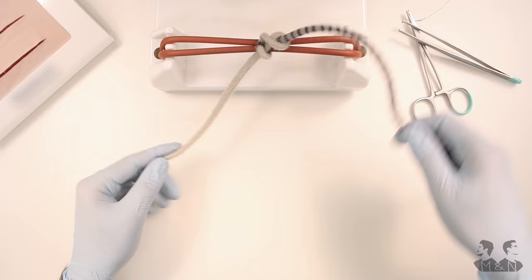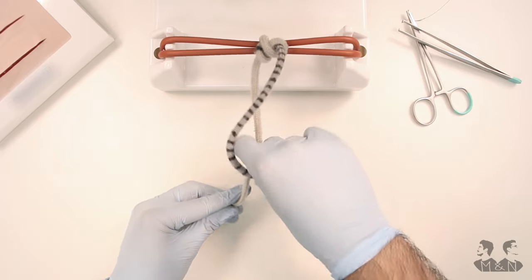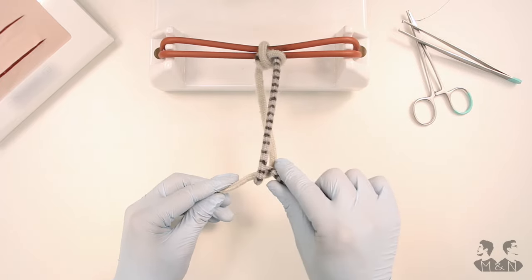The position of your hand and filament after the first knot suggests to begin with an index finger knot.